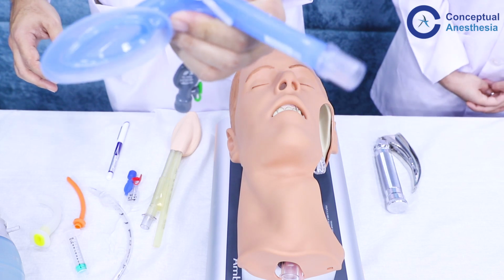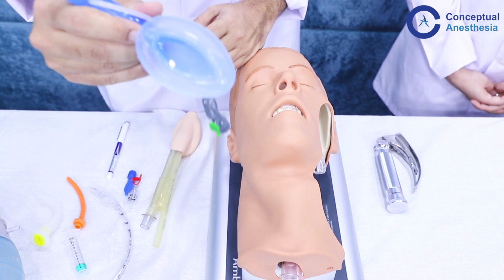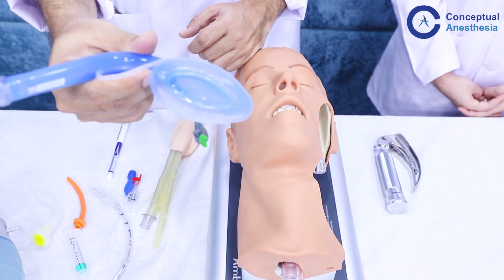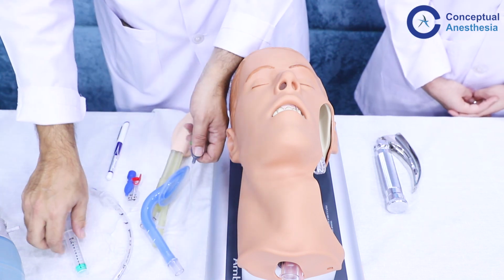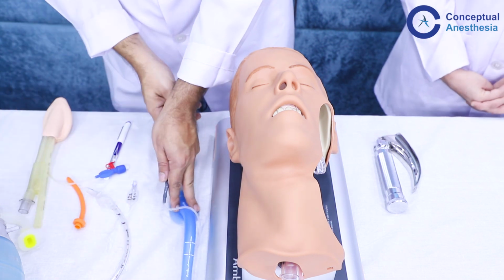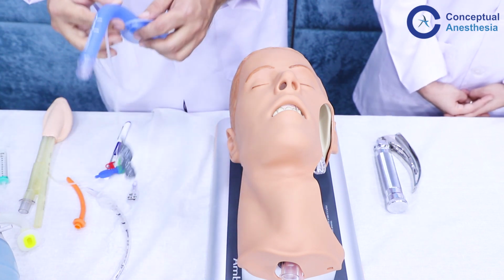Now let's have a look at how to hold the LMA while insertion. So you can see sir is placing his index finger right at the junction of the cuff and the airway tube. Now, important thing is you need to deflate the cuff completely before introducing it and make sure that it is completely flattened out. The LMA has to be chosen as per the weight of the patient. So we have different sizes of LMA, which we have already covered in our special chapter on supraglottic airway devices.